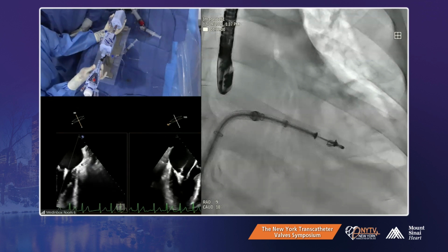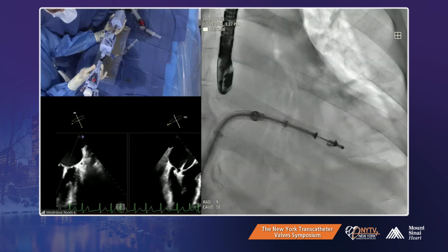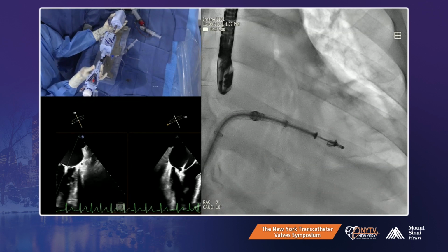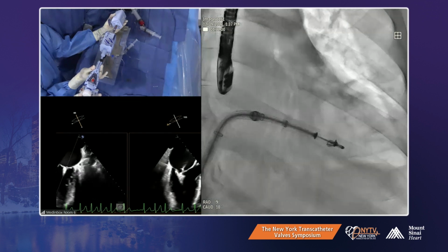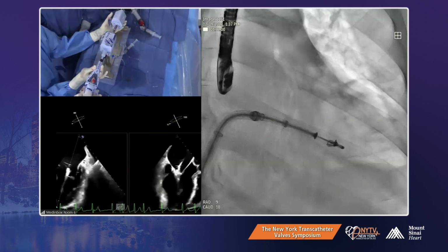You can see the shaft of the catheter going more laterally. It's going so much lateral already. We're anterior already, we're lateral already. Right. Close the clip a bit. It's better to start over again. Yeah, that's okay. I'd say that.